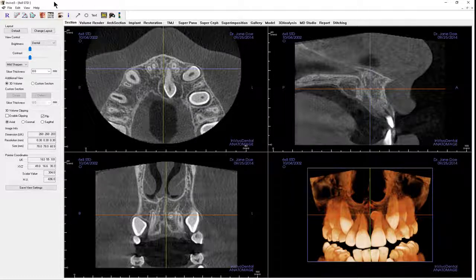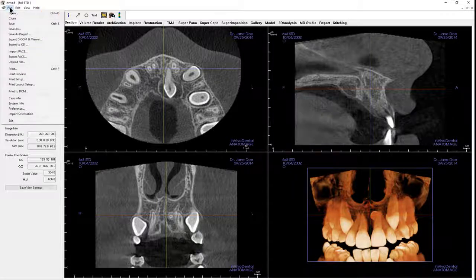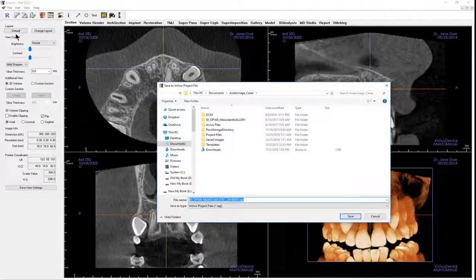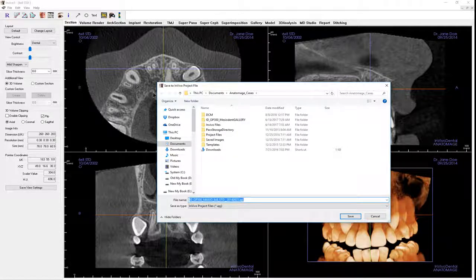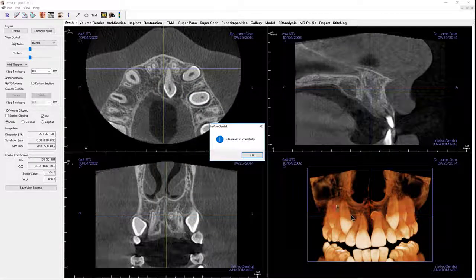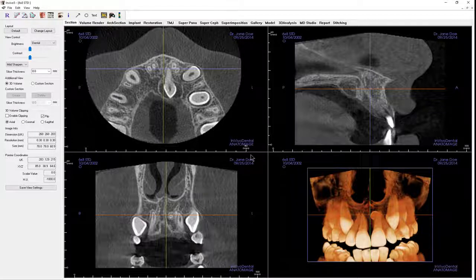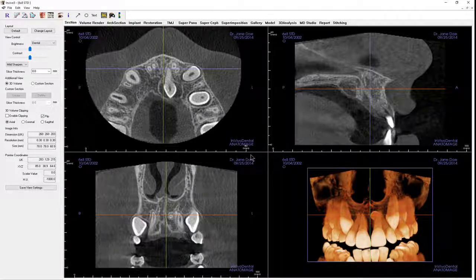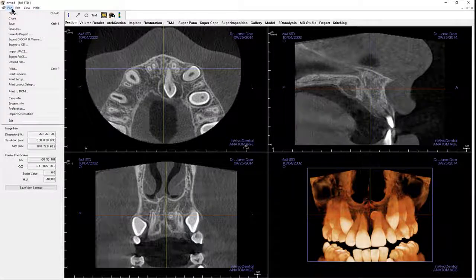If you have a computer storage limitation, you may want to save just the changes made as a project file. This file format is much smaller than either a DICOM or in vivo file and would therefore use less computer storage. It also opens faster than the other saved formats. However, if you take these files away from the network that the original is saved on, a project file will not open, as it needs the original data.